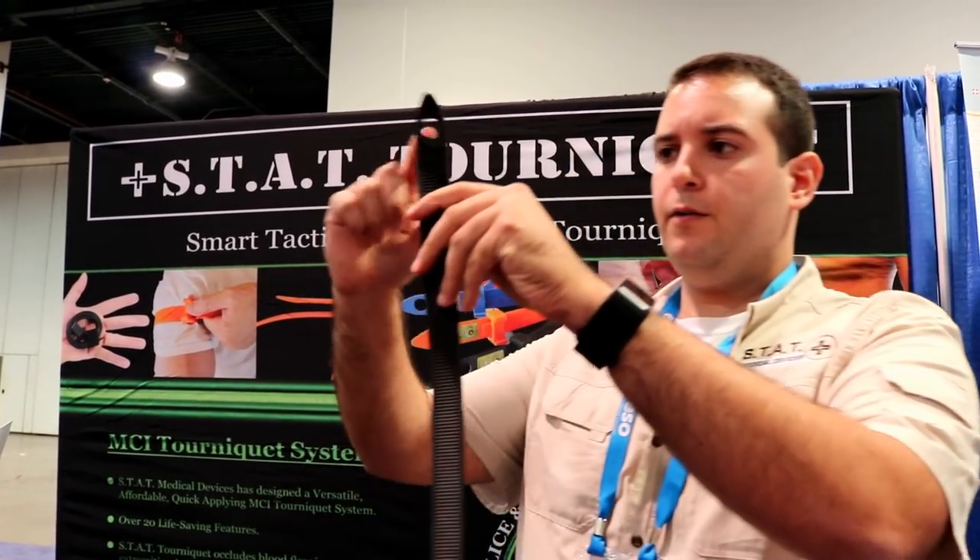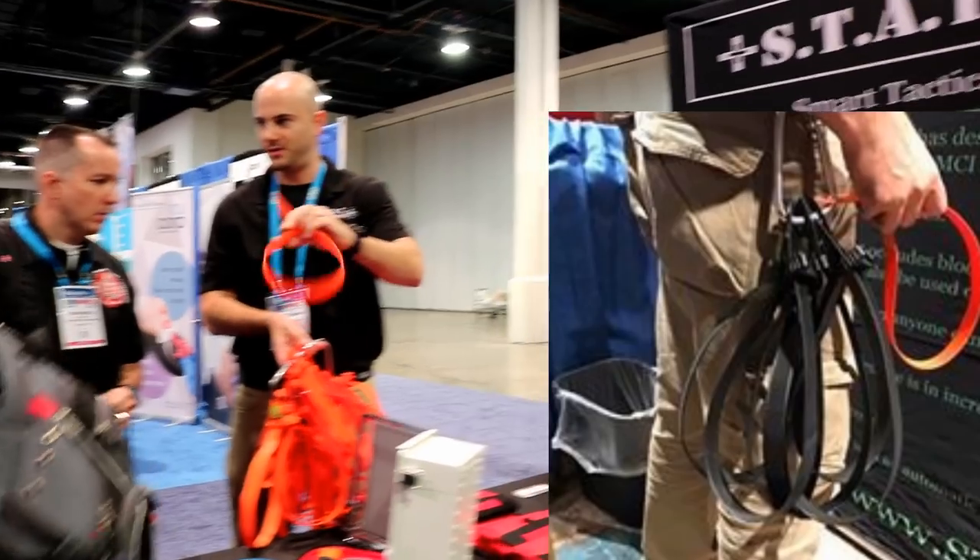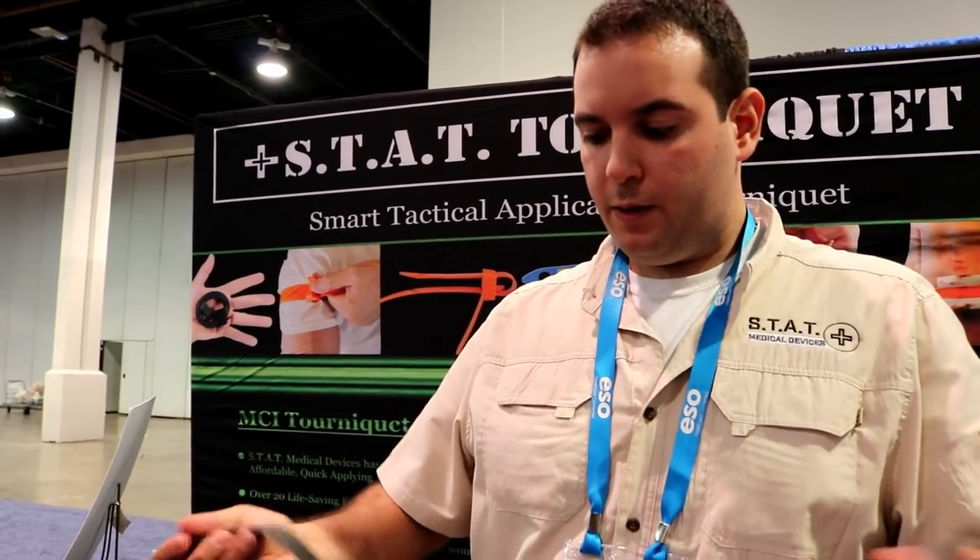The tourniquet can be stowed from the finger loop. As you can see, they can be pre-loaded on a carabiner for a quick rapid response — hang that in the back of a car, for example. You can get creative with it; there are many different options.